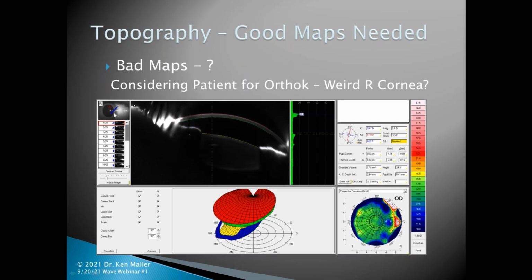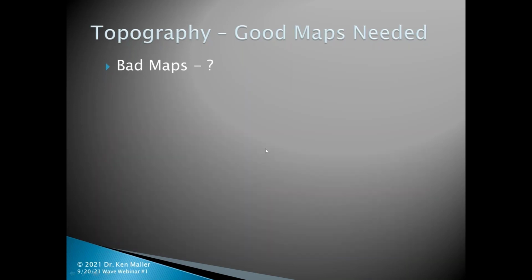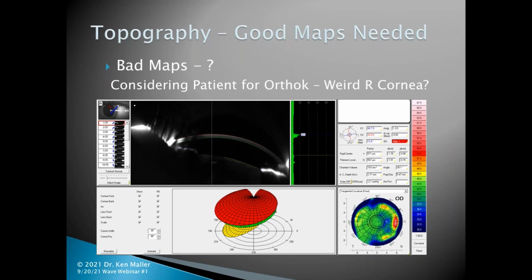Notice this image over here where this eye happens to be looking. We can also see up over here that this eye sort of looks tilted. Anyone who does Pentacam scans knows that this should be more in a straight plane, and we really should be seeing the arc of the cornea at an even height, both on the left and the right side. Really, what gave rise to a lot of this false data had to do with the fixation of the patient. Or I should say better, the operator was not paying attention to where the patient was fixating and gave rise to these erroneous data that was captured.